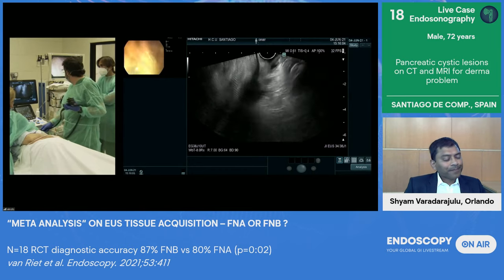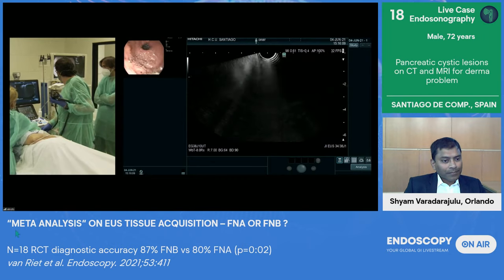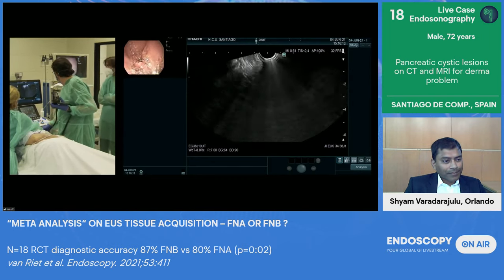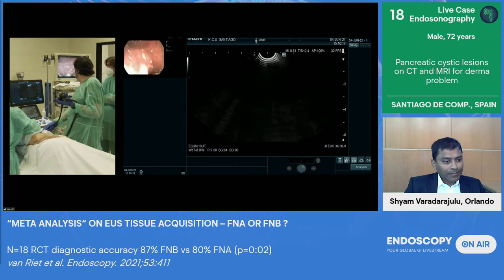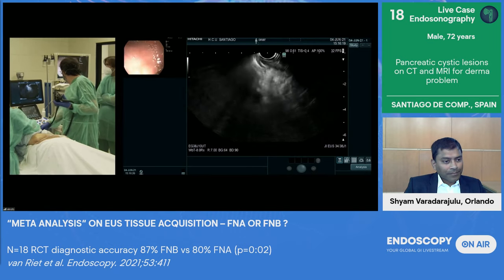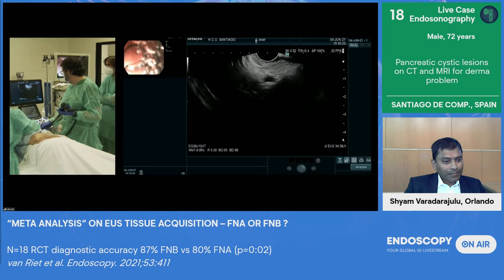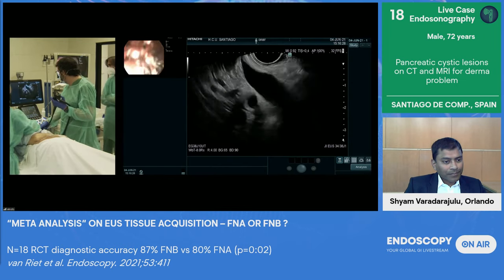Well, I can tell you that Jose has already come to the pancreatic head, and you will see that there are lesions not only in the pancreatic body or in the pancreatic neck, but we have also detected some lesions that I want to show you. Cystic lesions, not solid ones. So I am coming to a shorter field that I really prefer. So we're in the liver.